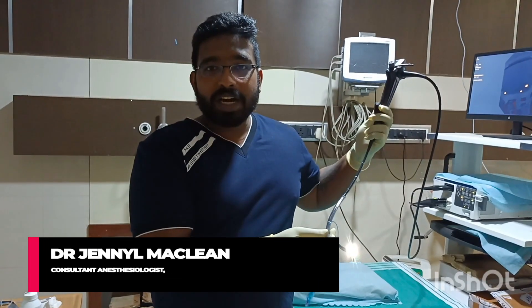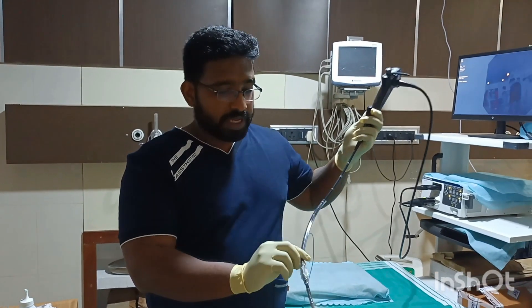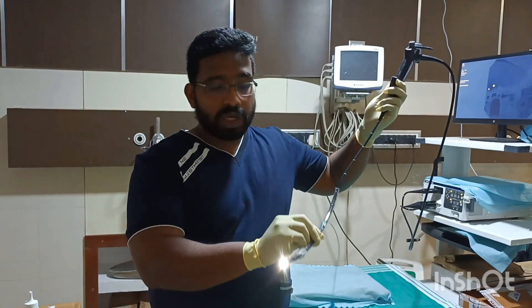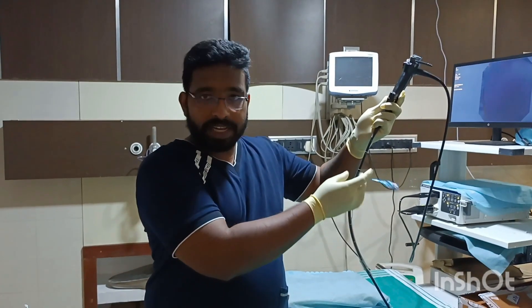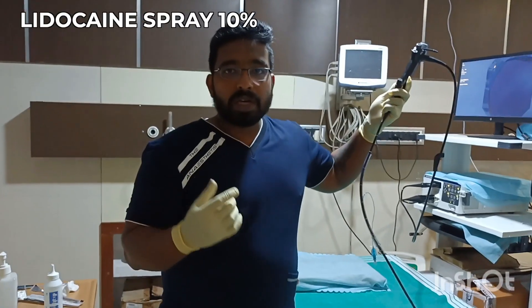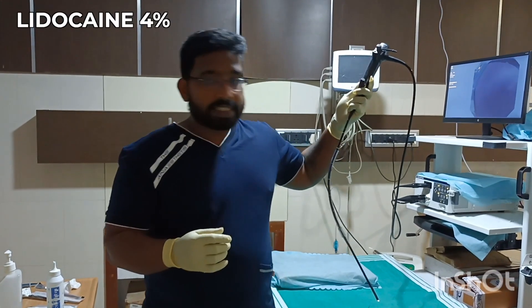Ladies and gentlemen, today we're going to see how a video lens scope is going to make difficult airway an easy intubation. You can see here a size seven endotracheal tube is being lubricated and primed and loaded onto the bronchoscope. I have given a 10% xylicaine spray and a transtracheal block to myself — let's see how it goes.